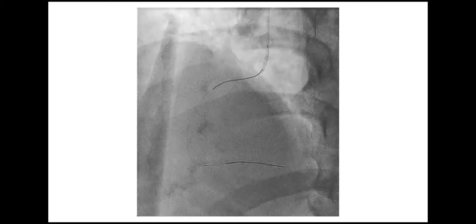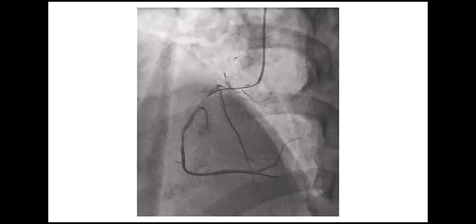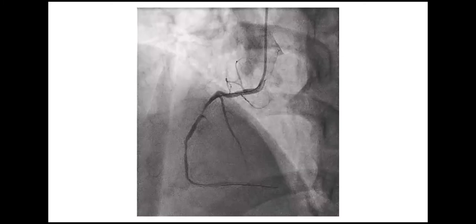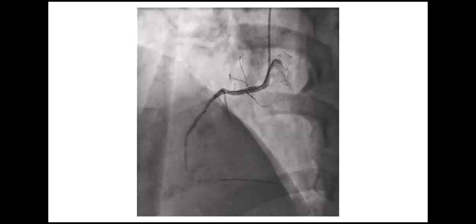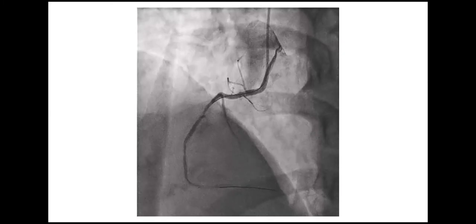So actually, I was thinking about this conference because I said it's a good case. When I was going to do this, I said I'll show this case on Saturday, but let me do an experiment. I gave atropine before I put the wire down. What do you think about the atropine? What do you expect? I gave 0.5 and then 0.5, total 1 milligram. No harm, actually. No harm and no response, Atahar bhai. Exactly.